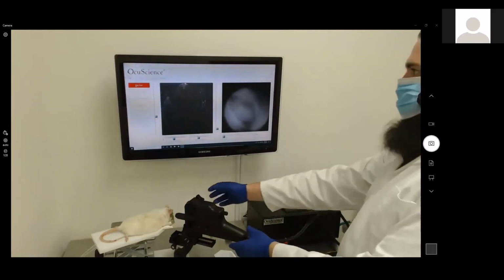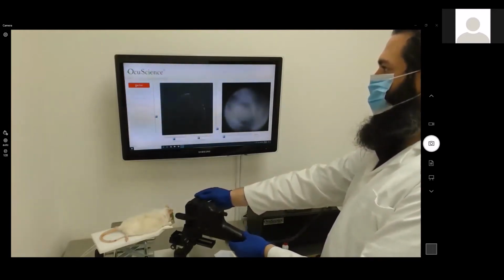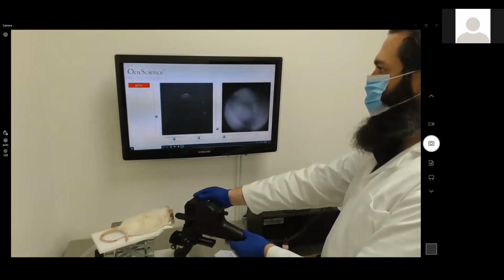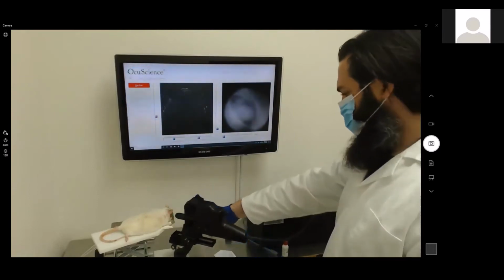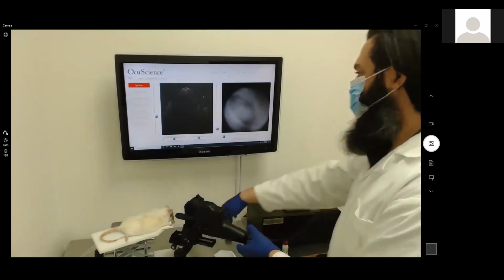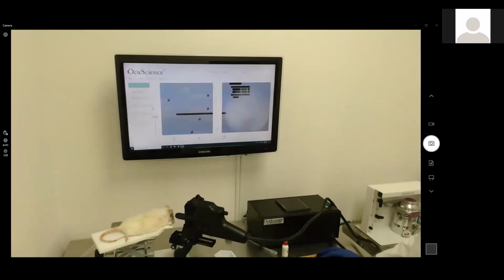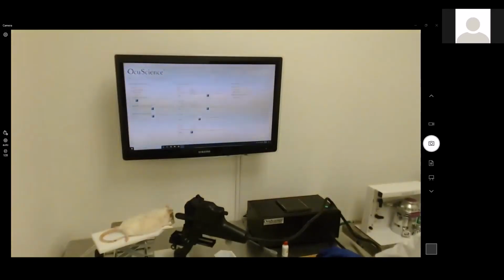Because we're compressing so much information in there, it kind of changes the geometry of what you see. Anybody who knows a mouse or a rat says that corneal curvature looks really weird. In fact, it is weird. But in post-processing, we're able to stretch that out so you get back to the normal curvature as well.